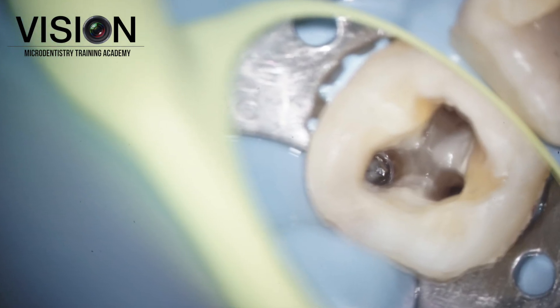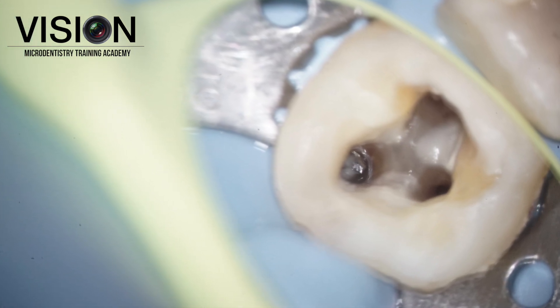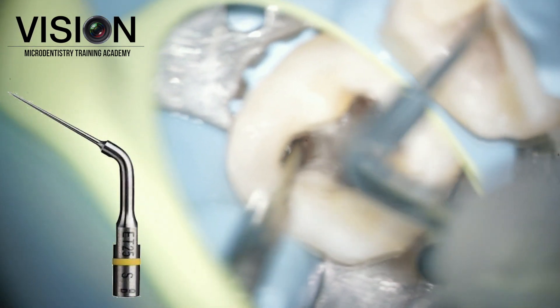We didn't start the case immediately. After explaining to the patient, he understood the problems that had to be treated and we did a pre-endodontic buildup and then located the fragment.